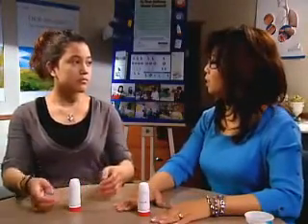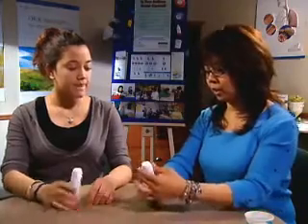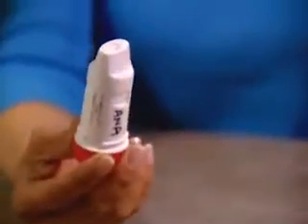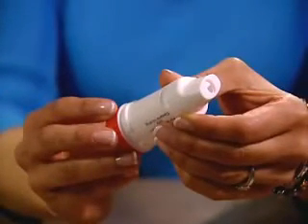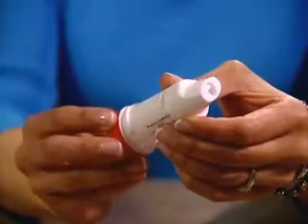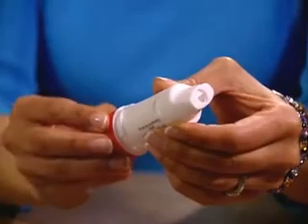Administering medication using a turbuhaler is comprised of 3 simple steps. Step 1. Unscrew and remove the cover. Step 2. Hold the turbuhaler in one hand and twist the colored bottom of the turbuhaler with the other hand. Twist the grip in one direction and then the other until a click is heard.